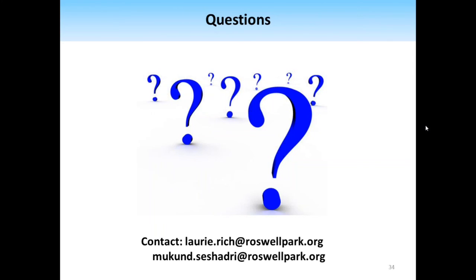And then for the second, what was the second question? I'm sorry. It was that carbogen changes hemodynamics as well as the actual SO2. So how would you separate these effects from each other? Right, that's a great question. When you give animals these gases, if you give pure oxygen to animals, it actually has vasoconstrictive effects, so it could potentially decrease blood flow. And carbogen as well, because carbogen has a little bit higher CO2, some people actually say it causes hypercapnia, which could increase blood flow. So there are those two things that are coupled together. It's a really good question. I'm not sure how exactly we would be able to separate out the two different effects.